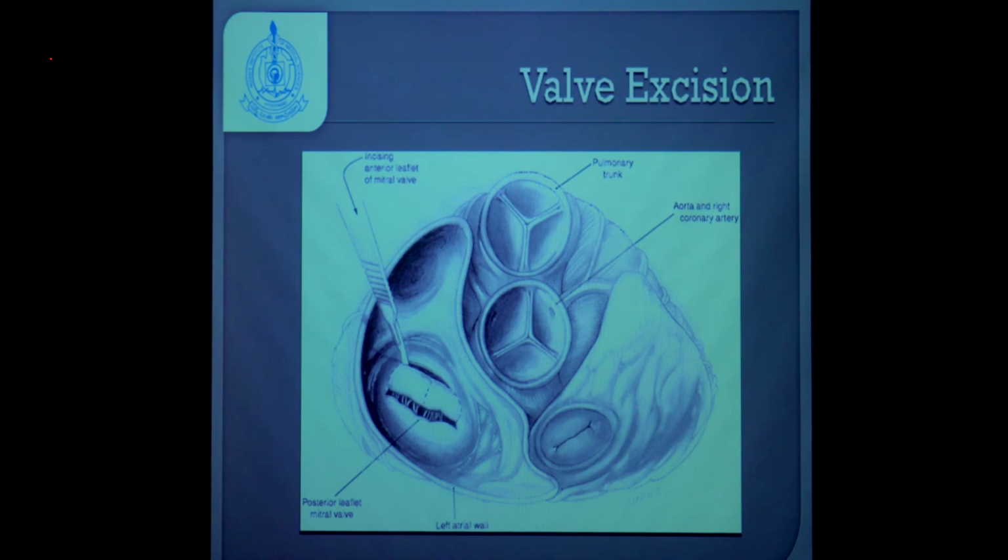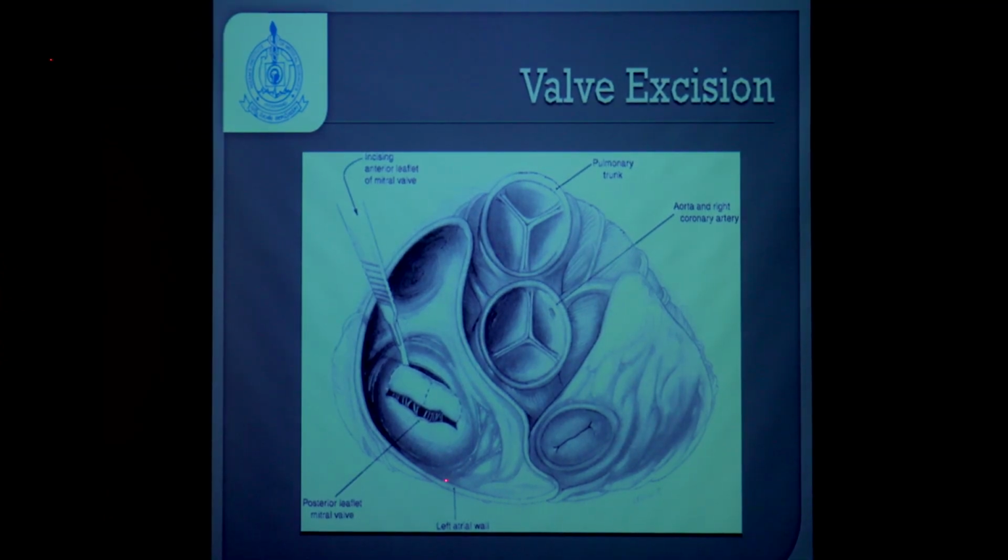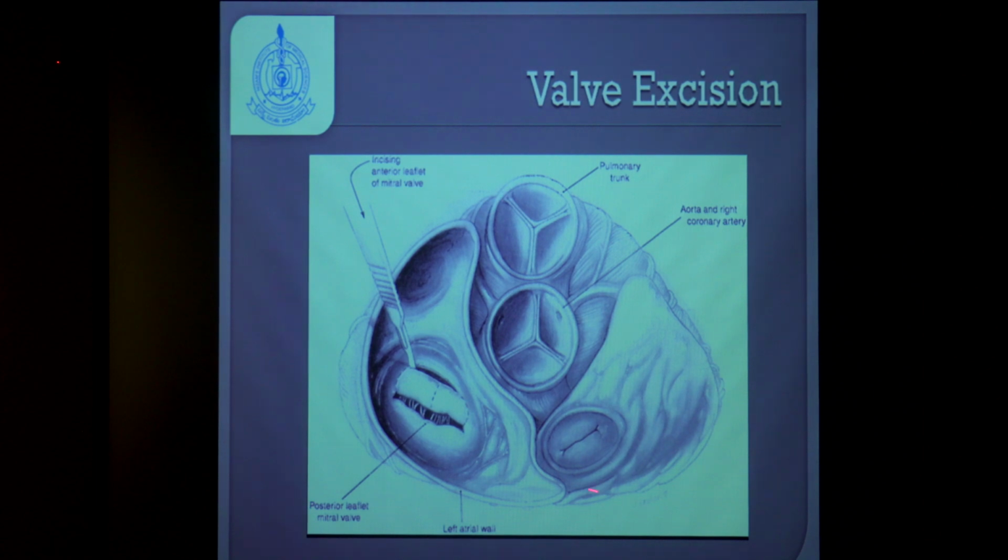In case of a mitral regurgitation, if there is a chance of saving the entire mitral apparatus, I directly start taking sutures. Otherwise, most commonly we use a forceps or a mitral hook, lift the anterior mitral chordae and examine the anterior mitral valve. An incision is placed exactly at the A2 segment, and from the A2 segment the incision is extended first anti-clockwise and then clockwise. Then, depending on the surgeon's perspective, once the anterior mitral leaflet is partially excised, we can start taking sutures from the 12 o'clock position, and using the leaflet as traction, we can keep taking sutures all along the mitral annulus.